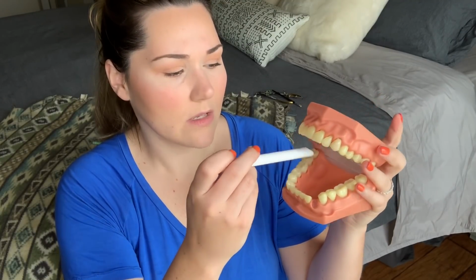And then I'll go up front here, move the cheek if he's going to rinse, so I can get the rinsing. With their tongue and their cheek tissue, try to keep this small part towards the teeth and not the cheek. And then you can move their tongue out of the way, especially for these posterior ones. They're going to want you to hold the tongue out of the way, kind of like this. So you're keeping the tongue back here while they're working on these. You definitely want to do that in the lowers too.